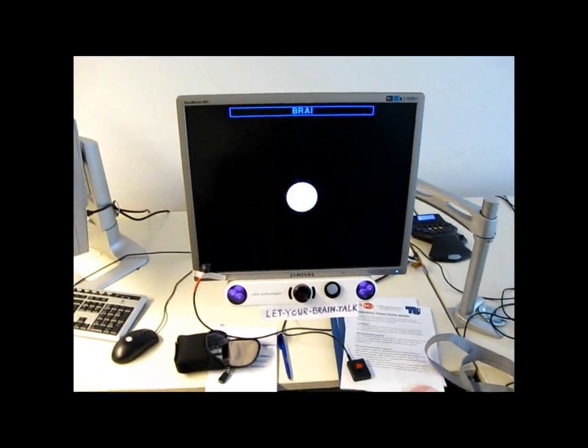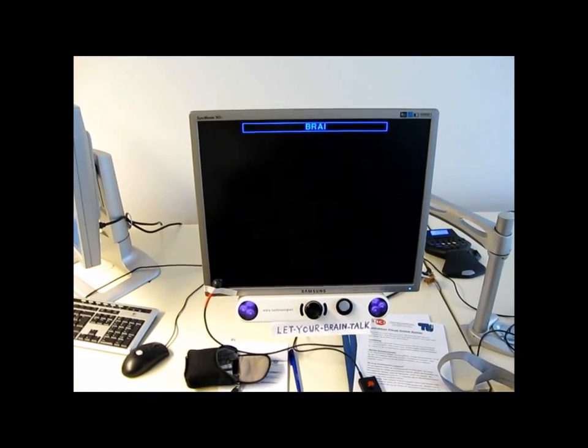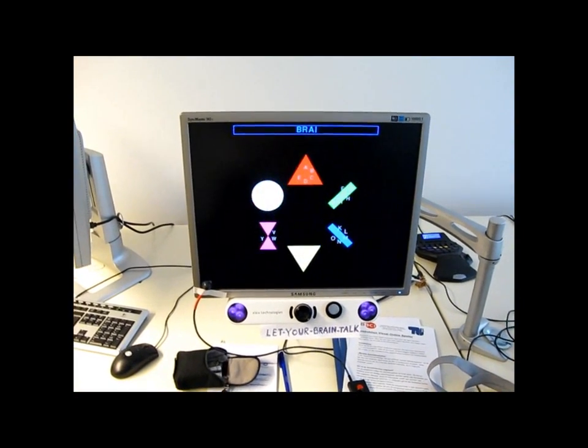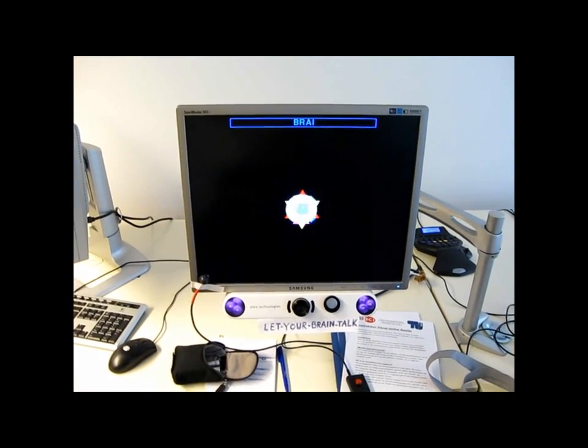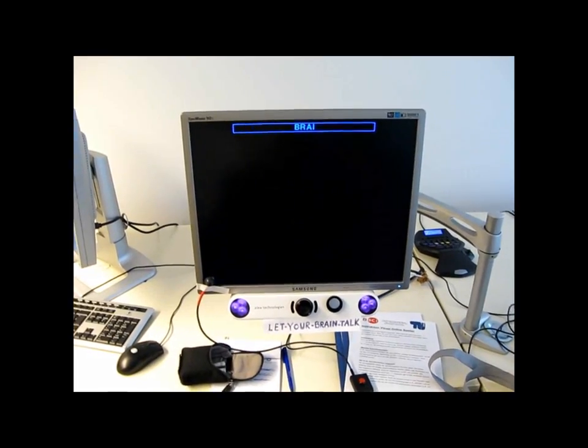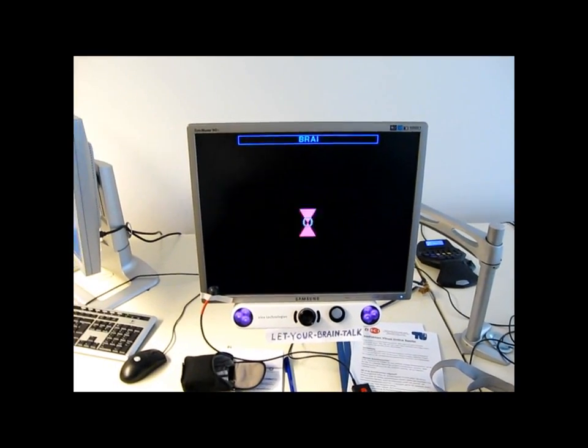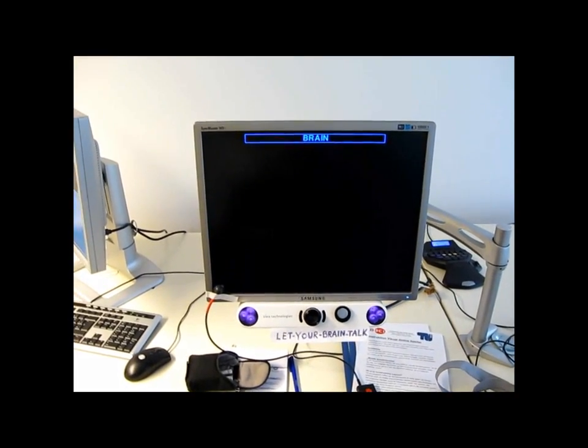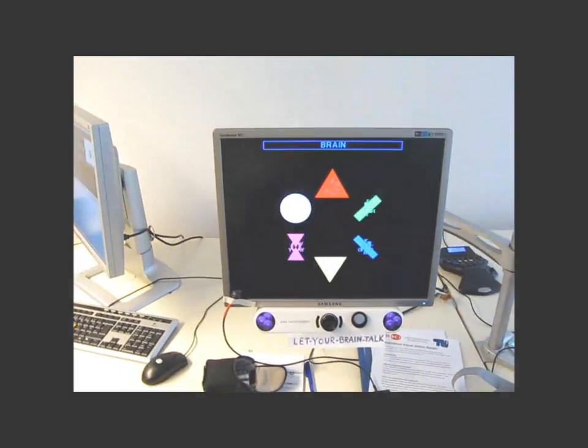As you can see here, I am spelling brain. Let's see if I can get the N. Yep, here we go, I just spelled brain.